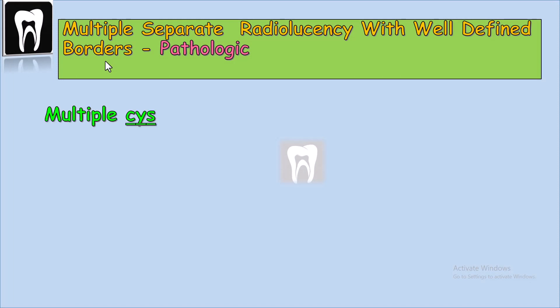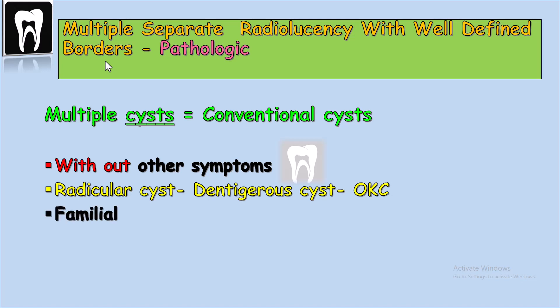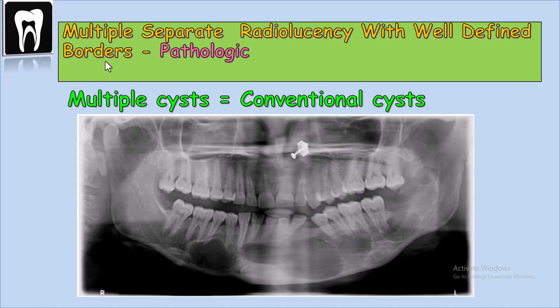Multiple cysts — or multiple conventional cysts — can be seen inside the jaws even with no syndromic symptoms, such as dentigerous cysts, radicular cysts, or even OKC. It can be familial, meaning one of the parents may have the same history. But it is very important to confirm there are no syndromic symptoms. In this panoramic radiograph, you can see multiple cysts in the mandible starting from the left ramus, molars, and premolar area, the symphysis, and the right molar and premolar area. Clinical examination and history showed no syndromic symptoms, so we can say these are conventional cysts.